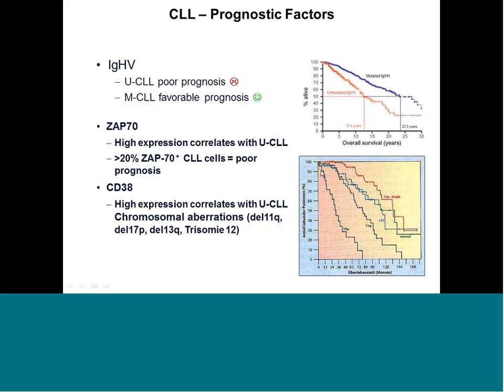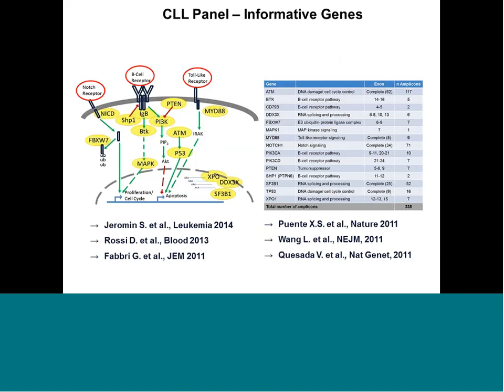And there are subgroups of patients that have a very aggressive form of CLL, which need early treatment, and it is important to classify the patients according to their risk score. And so we started out and analyzed all genes that were reported from the big international genome consortia for CLL, which is genes in the B-cell receptor signaling, in the Notch receptor signaling, Toll-like receptor signaling, also genes that signal DNA damage like p53 and ATM.